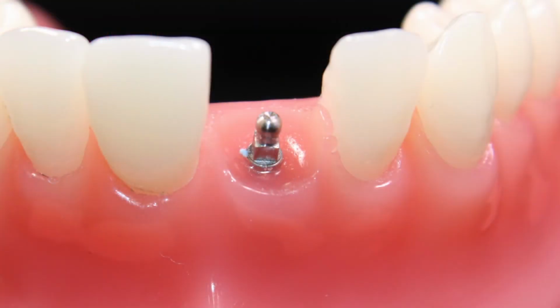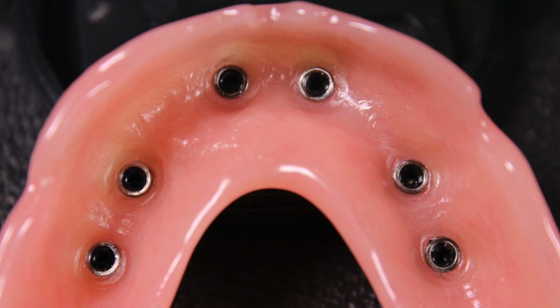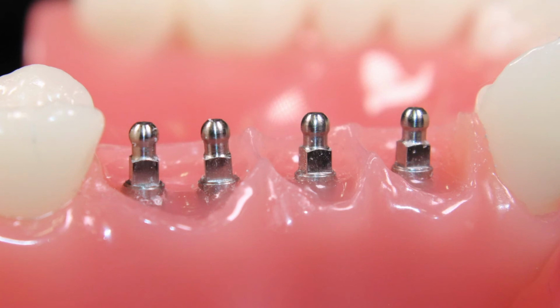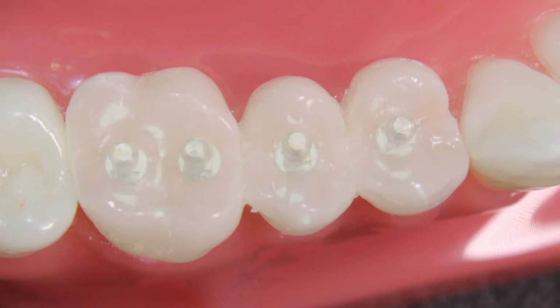There's actually a titanium steel ball on the end of it, and there's a rubber O-ring inside the housing, and when it slides over the ball, it locks it in. So if you have 4 of them or 6 of them or 8 of them, depending on what you have, it just gets increasingly stronger. And in fact, when you get enough of them on there, it's kind of challenging to take it off, which isn't such a bad thing. Anybody who has a denture would say, the harder it is to get off, the better. Obviously, we can get them out, but they really are that strong.